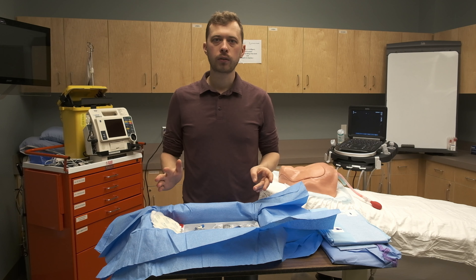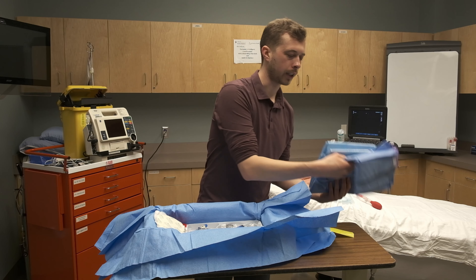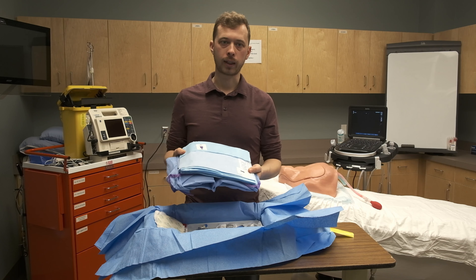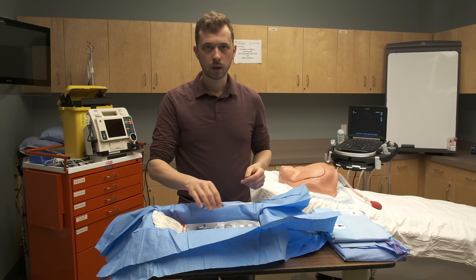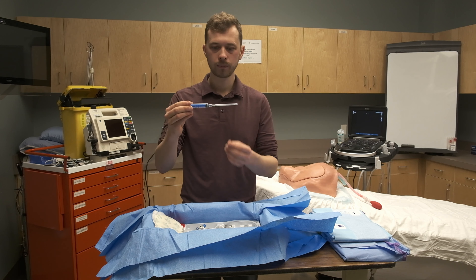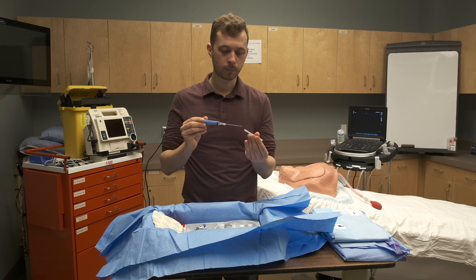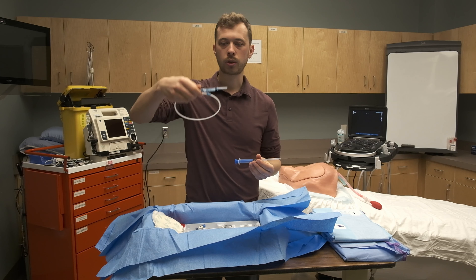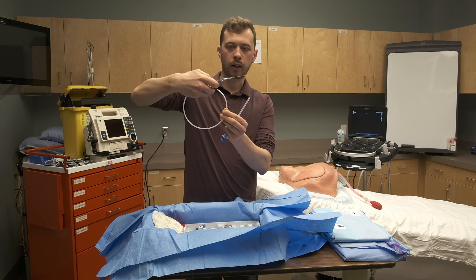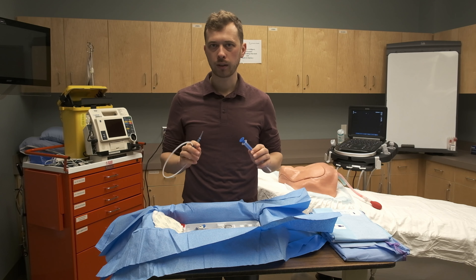Let's have a look at the equipment for central venous access. This procedure is done under sterile technique, so this kit actually comes with a gown as well as a sterile drape to cover up your patient. There are basically two really important things to the Seldinger technique: a needle — quite a large needle with a large hollow compartment in the middle — and the hollow compartment is used to put a wire through. The wire comes in this rolled up tube that you can push the wire out of and pull it back. Let's have a closer look so I can demonstrate how that works.